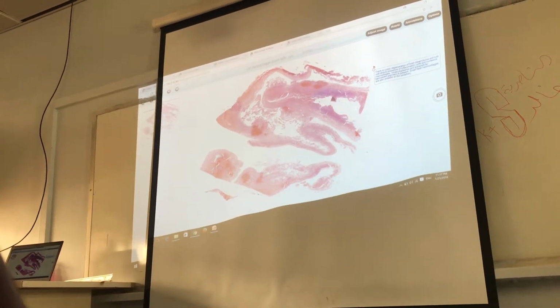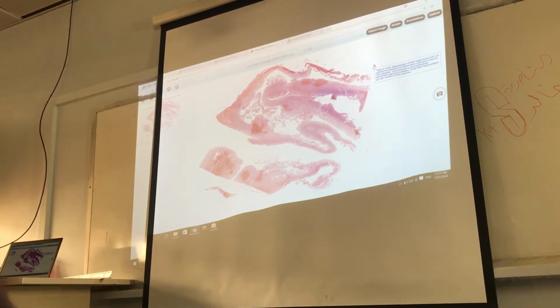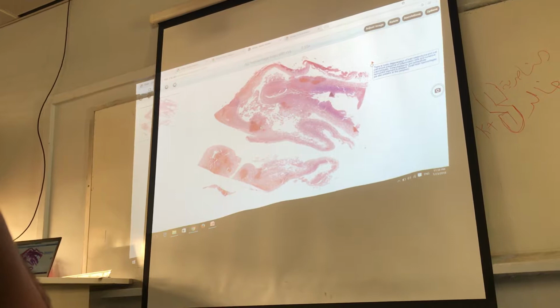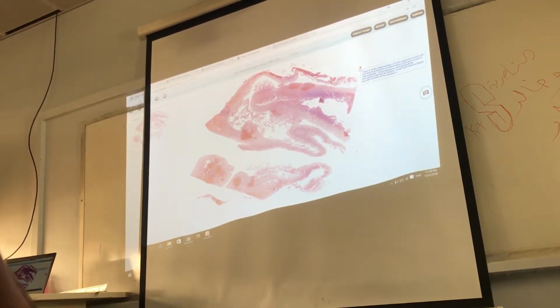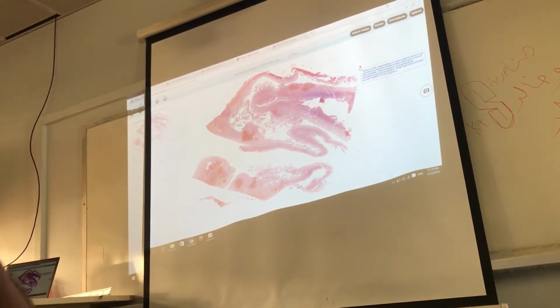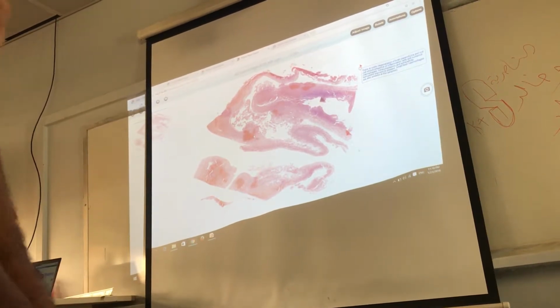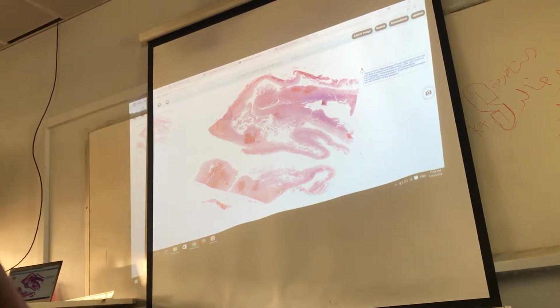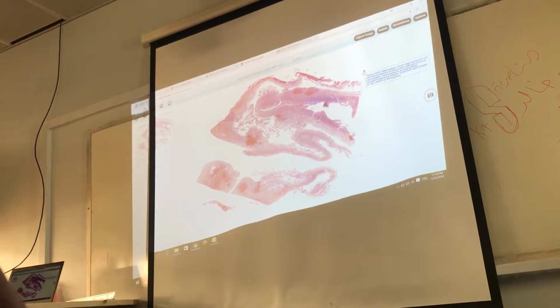And what you are seeing, these red ones, these are recent hemorrhages. Red ones. Suppose you see old people, after 50, 60 years of age, with dots on their legs. Why? You mean brown dots? Yes, brown dots. Also in the hands. Why is melanin there? They are fully covered.